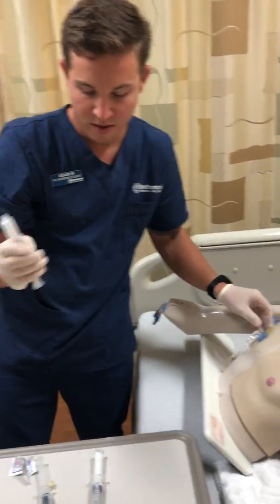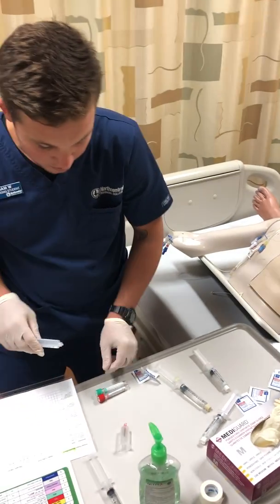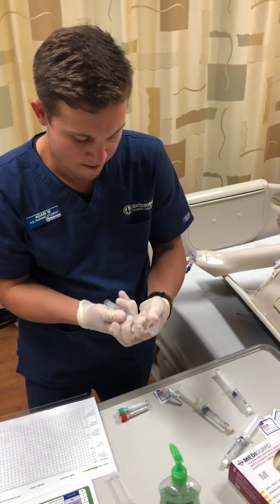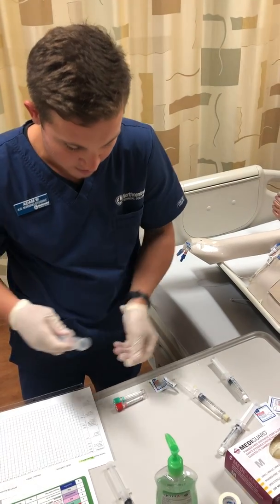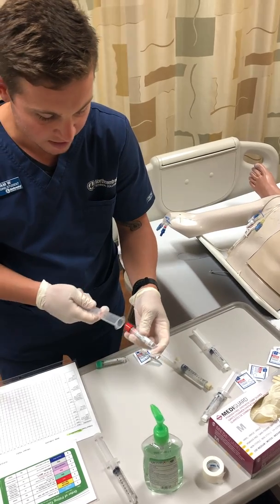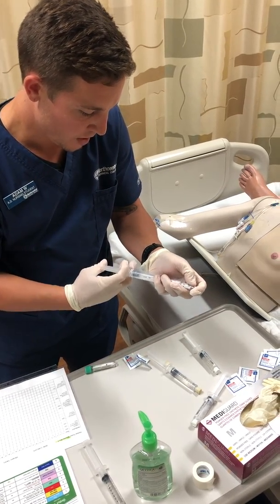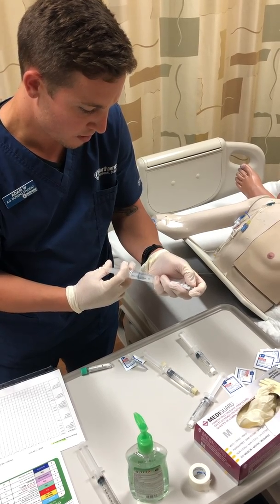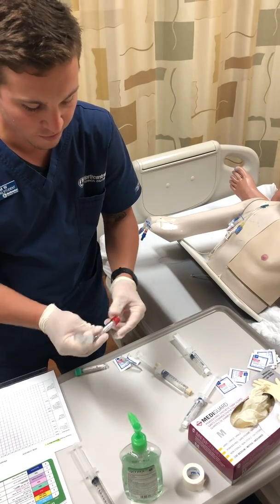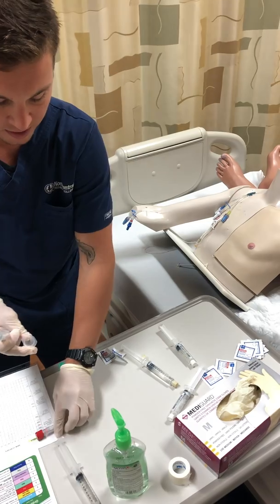So here's our blood. What we're going to do now is collect our blood. So here we're going to connect. It stays. And then our order again is red, then green, or mint. Here I'm going to insert and take what we need. It's about right here. Okay. Remove, you're going to rotate like this. Okay, you're going to set that aside.